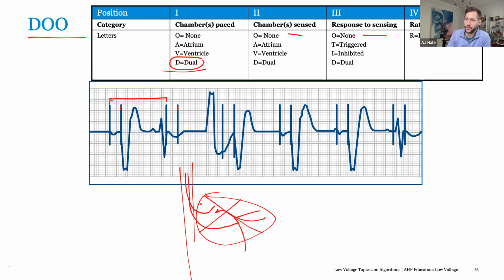At the same time, when the atrial timer starts, it starts what's called your AV delay, the delay the device waits to pace in the ventricle based on either a sensed event in the atrium or a paced event in the atrium. Our paced AV delay looks like around 200 milliseconds. The device waits 200 milliseconds, nothing occurs, so it ventricular paces. This starts your ventricular timer over.